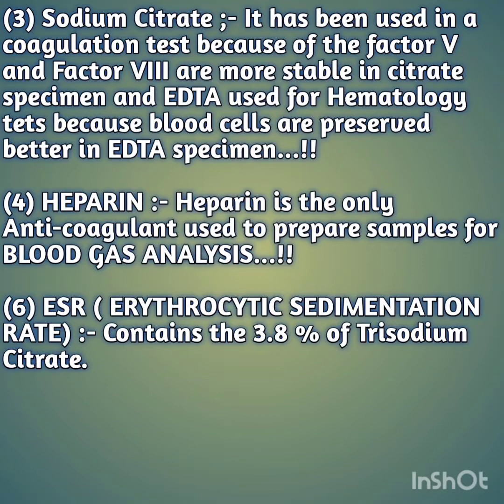Okay, now the last one is ESR. We have the ESR tubes also, right? ESR stands for erythrocyte sedimentation rate. In the ESR tube you will have 3.8% trisodium citrate. Okay friends, so this is regarding your order of draw.